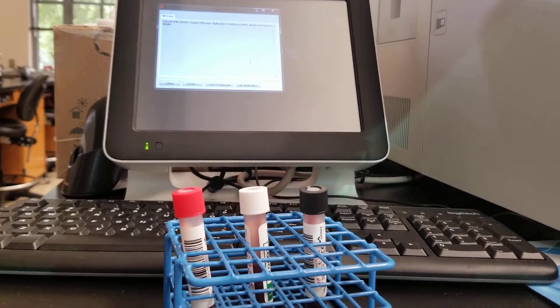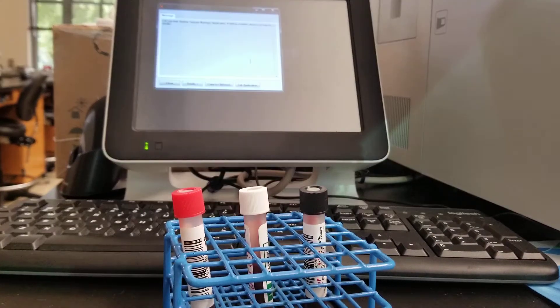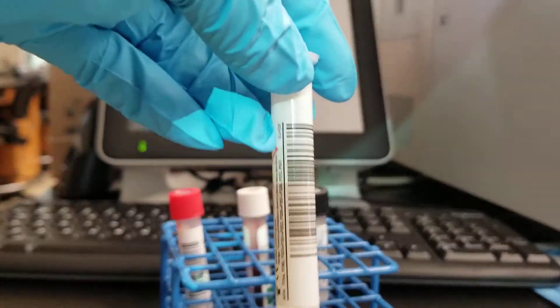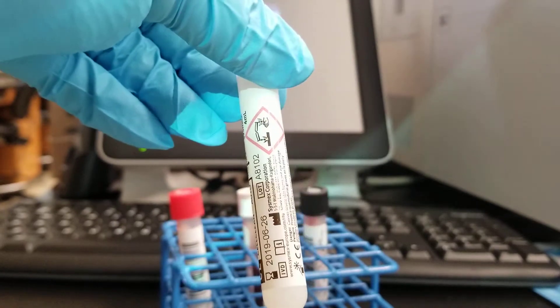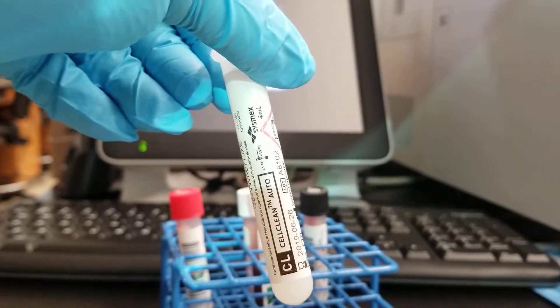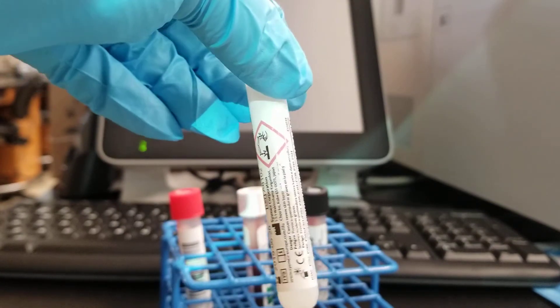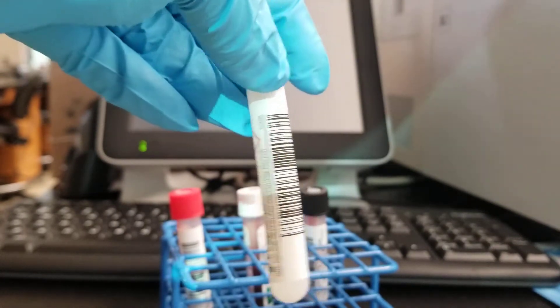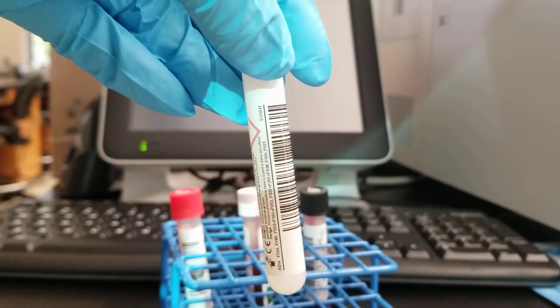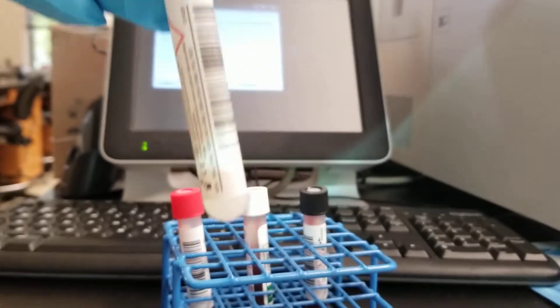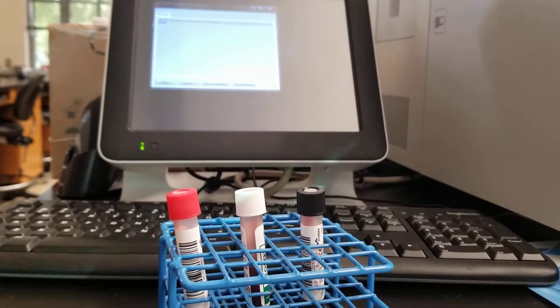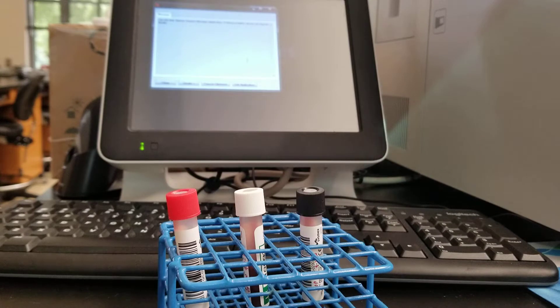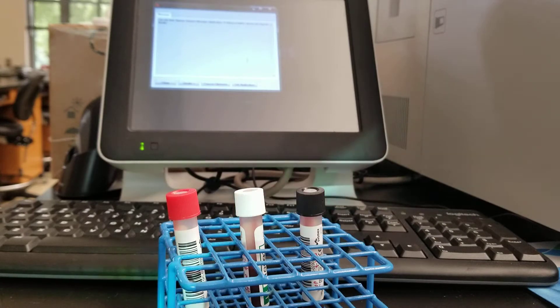It comes in a little tube here that has a barcode. We put it into the manual mode. I'm going to show you where that is when we get there.